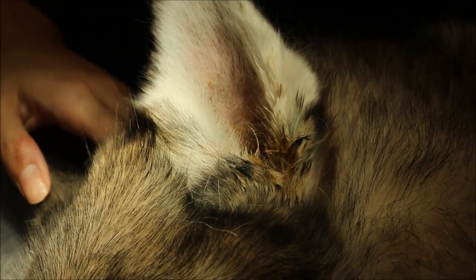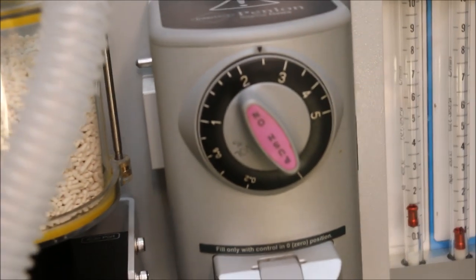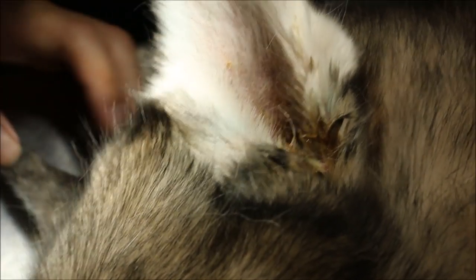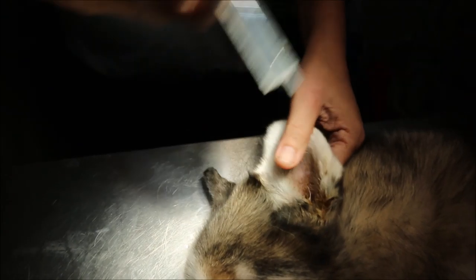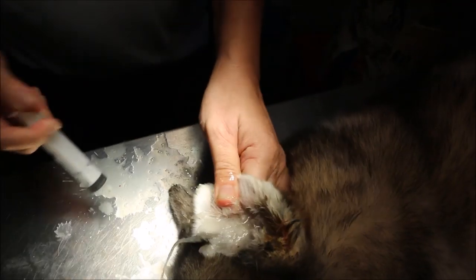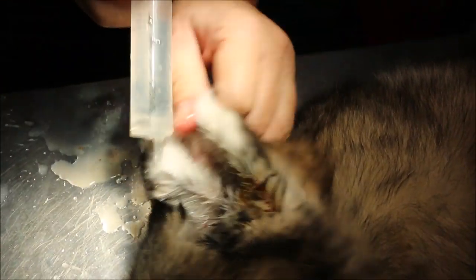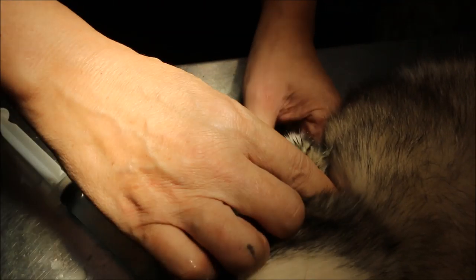We set the isoflurane at two and a half percent as the maintenance dose. Now for the irrigation — we actually just use clean water. We put it in with a syringe, probably 20ml, and just irrigate the pus out. You can see the debris and pus coming out.